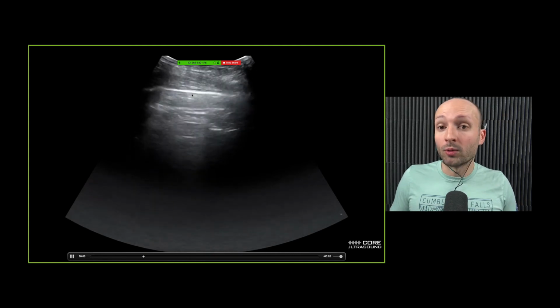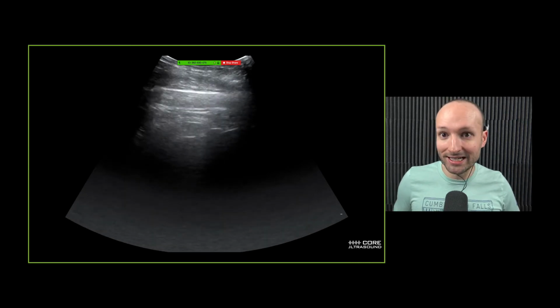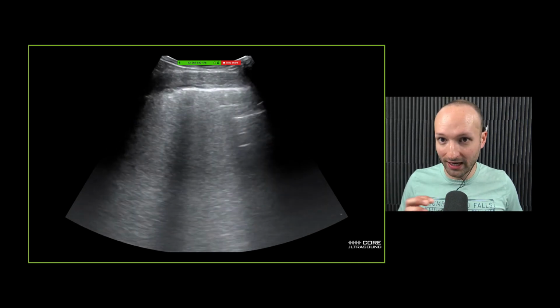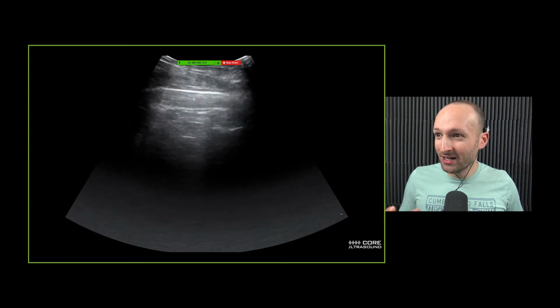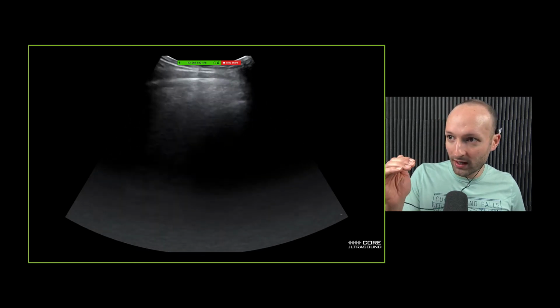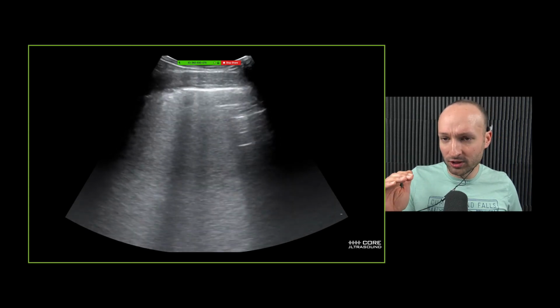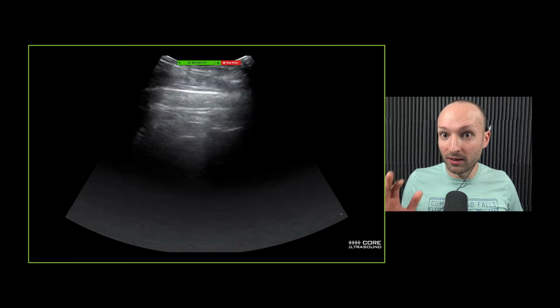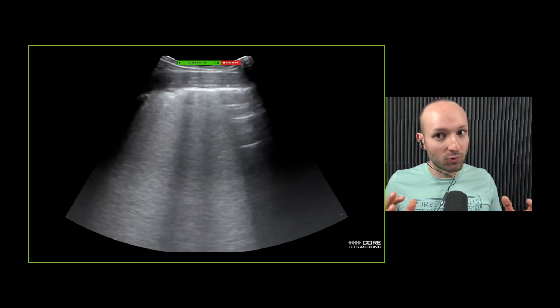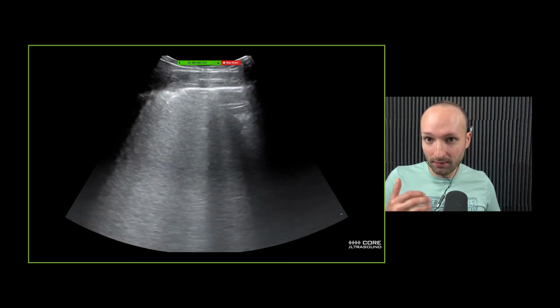But remember, when you're looking for pneumonia, you have to look in all regions of the lung. So I went digging. I went exploring. Kind of wandered around the guy's chest with my ultrasound transducer. And I found a section that had a bunch of B lines. So you see one area at the very beginning of the clip with no B lines whatsoever, and then I go down to another area and a bunch of B lines. So that made me think, there's one region that has a bunch of B lines. I better look even deeper, even more in depth.